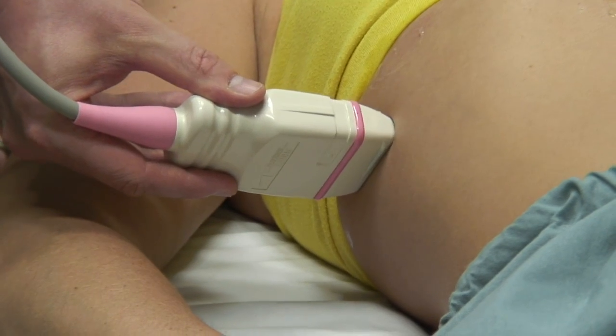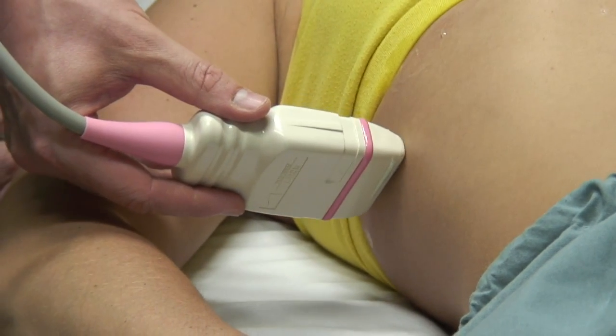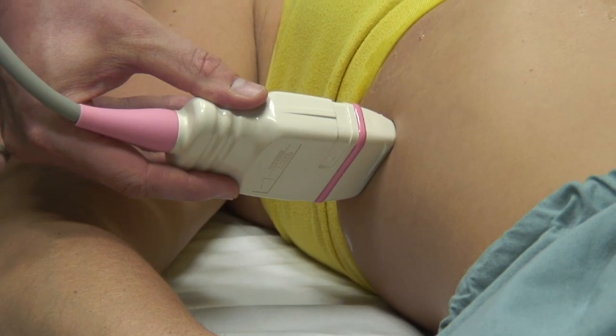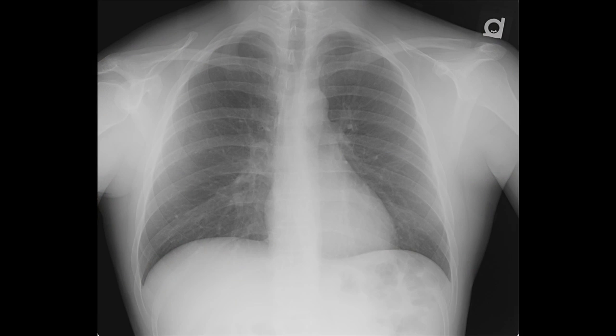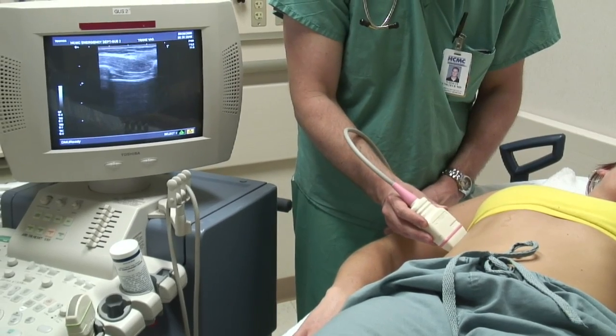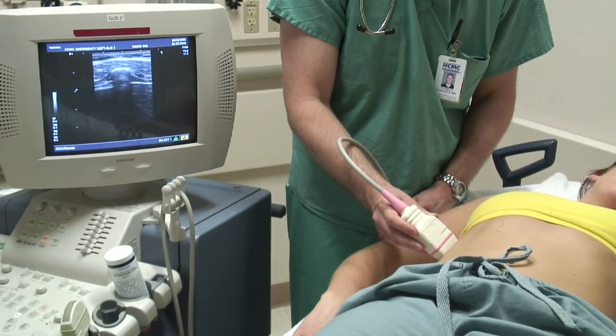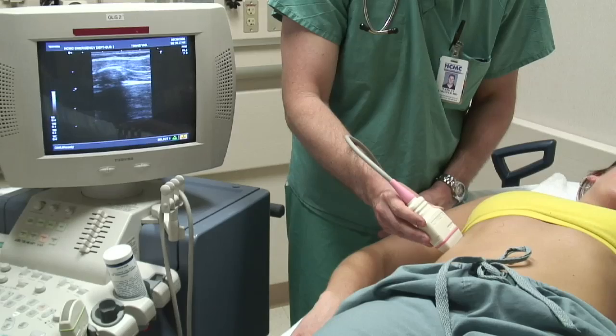Slight pressure with the probe will palpate the precise area of the visualized fracture, further confirming that point as the area of maximal tenderness. This is a chest x-ray from the same patient just before the ultrasound was performed. Even on close inspection, there is no evidence of the rib fracture. With a little bit of practice, the ribs can be followed quite quickly, with the area of fracture jumping out and appearing obviously different from the normally smooth cortex of normal rib.